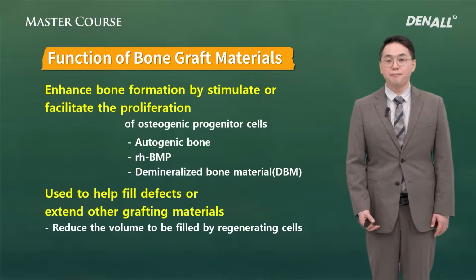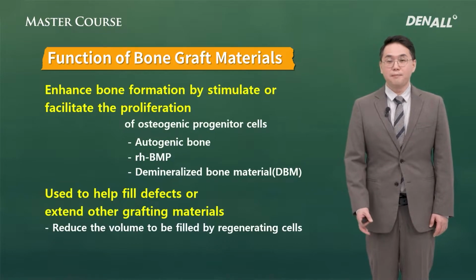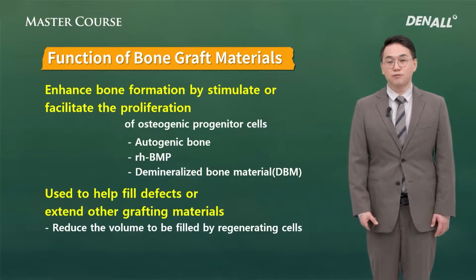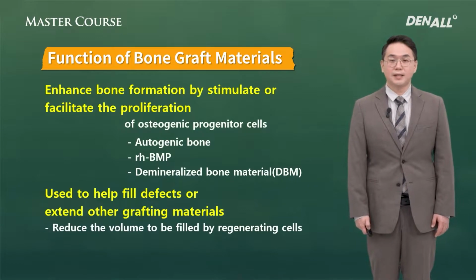If you use a certain bone graft material like DFDBA with higher BMP contents, you can differentiate mesenchymal stem cells into osteoblasts, but that role is minimal.